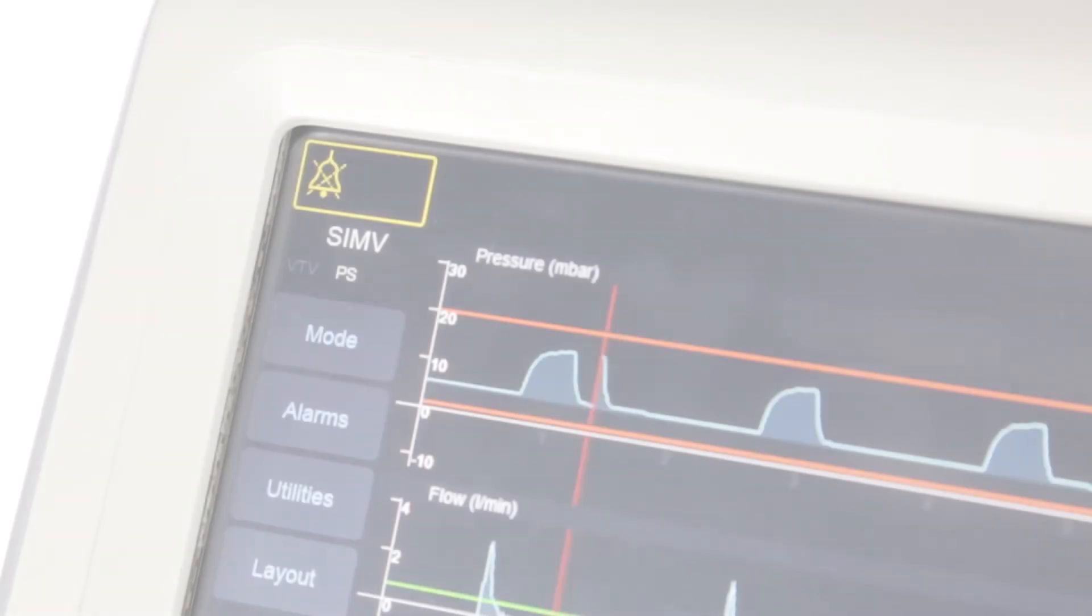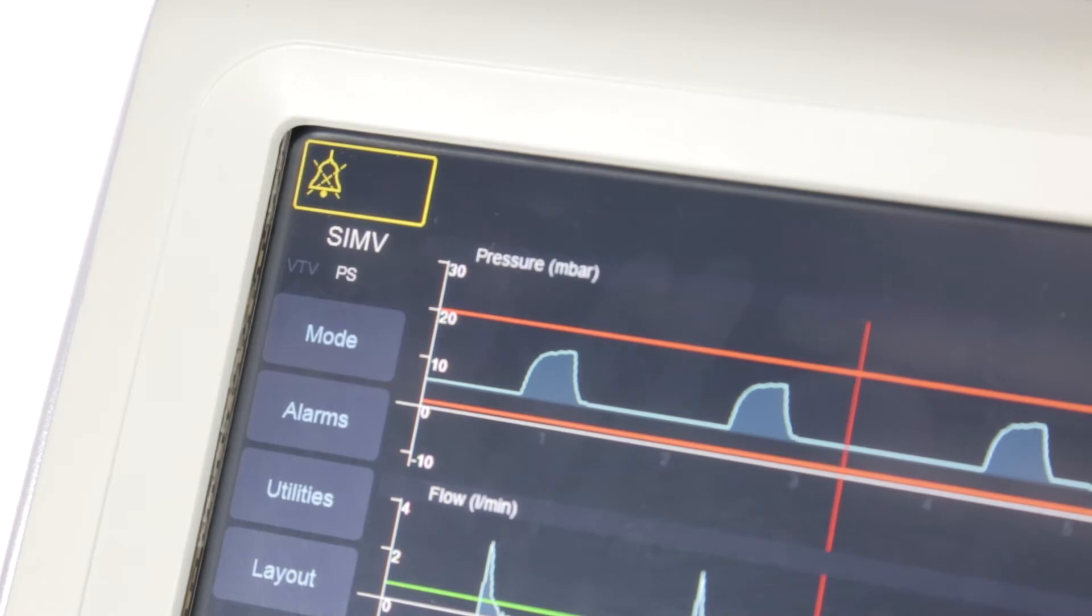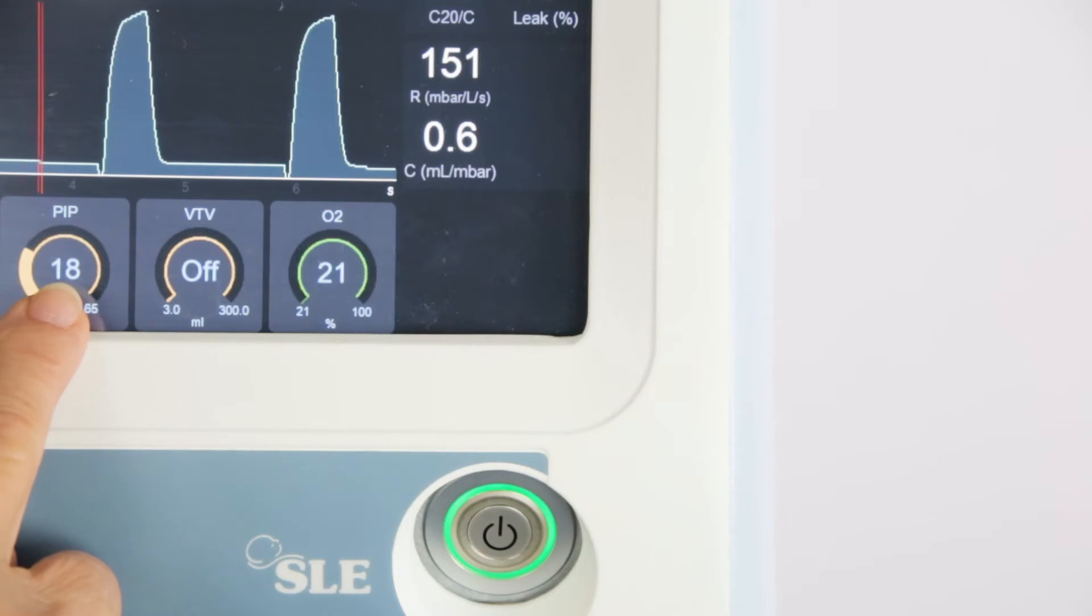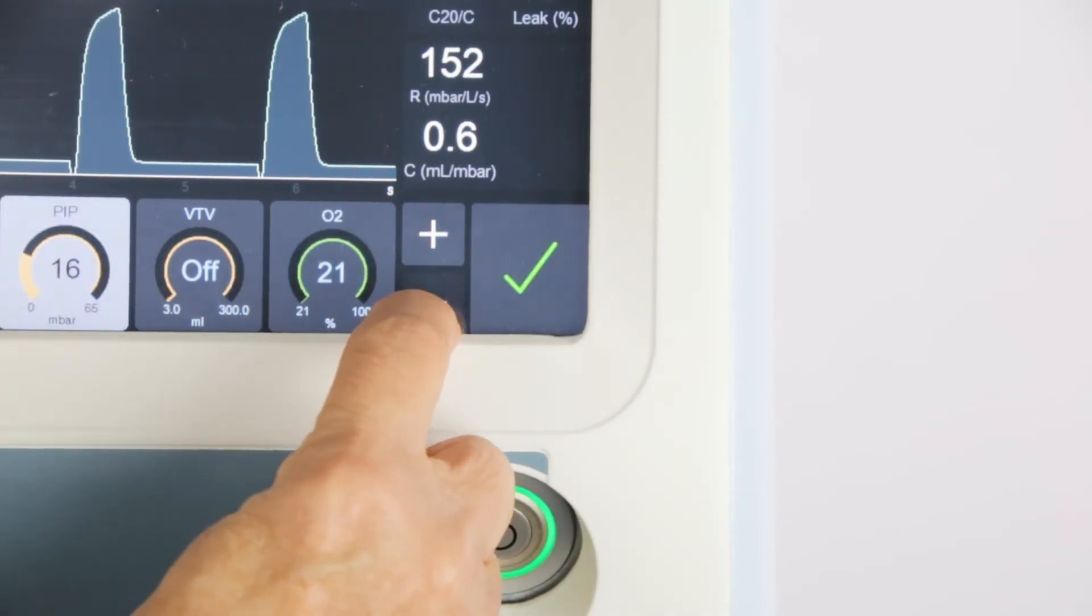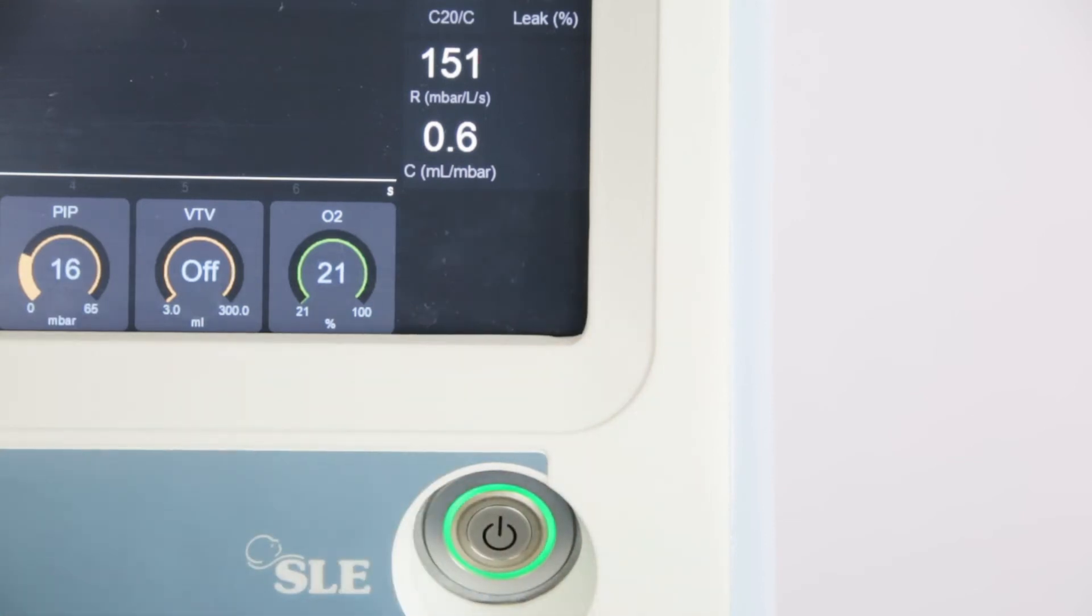Pressure support ventilation, PSV. By introducing PSV, you will now be supporting every breath, both mechanical and all spontaneous breaths. The pressure for the spontaneous breaths can be decreased step by step to facilitate weaning, leading to successful extubation.